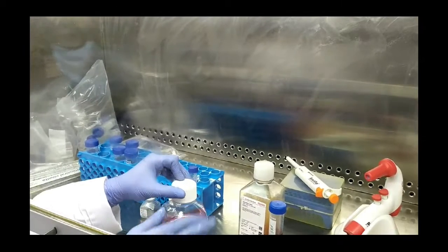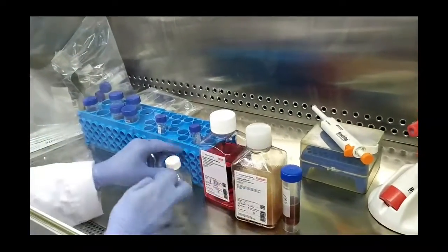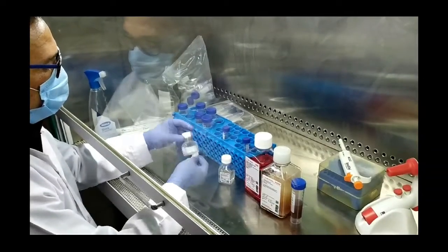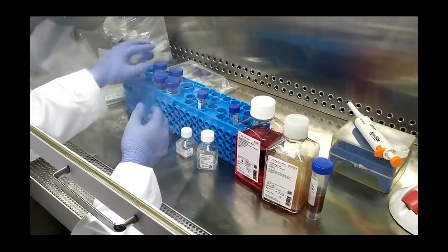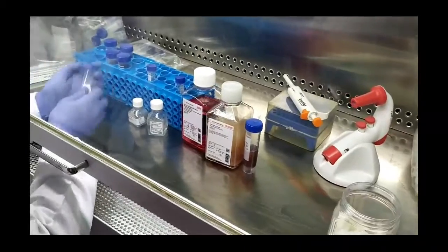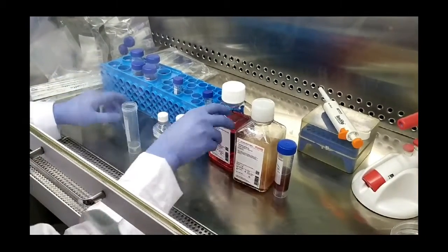The media has different components depending upon the requirements. Today the media which we will be using is DMEM — that is Dulbecco's Modified Eagle Medium — which is a very common medium used for animal tissue culture. You have to wipe all the bottles with ethanol because they are taken out from the fridge. The media and the components need to be kept in the refrigerator because they contain many heat-sensitive materials. After wiping all the bottles, we are going to make a complete media.